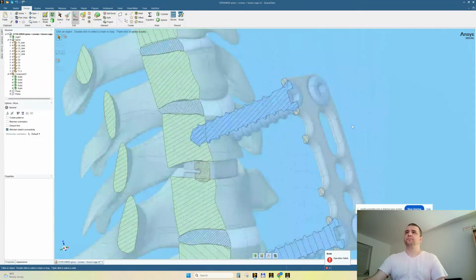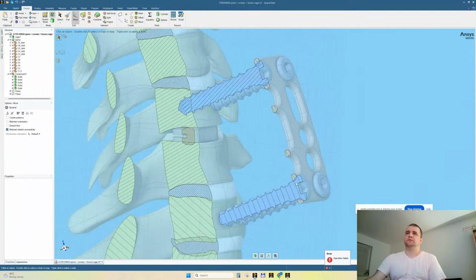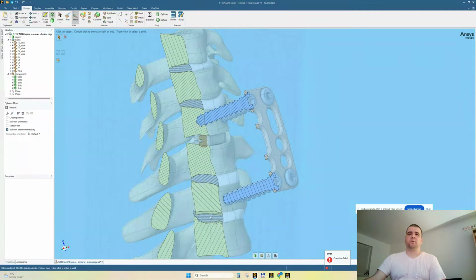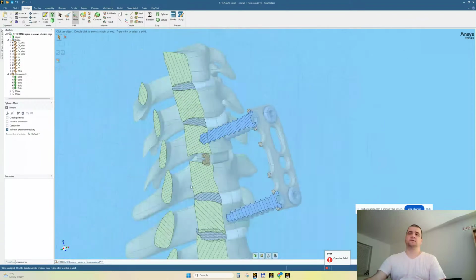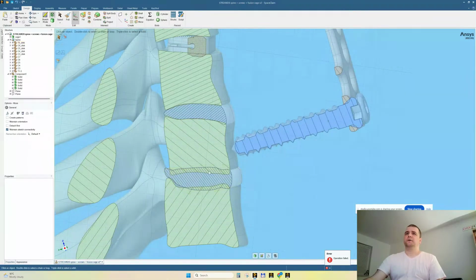So I can see now that the screws are definitely too big, yes. Also the section is not exactly through the axis of the screw. Now I also see that the discs need scaled down. We need to make them smaller because the collision is too much. This is a good scale here. Also kind of good and also kind of good. Only here, this is too much. We will solve this a little later.